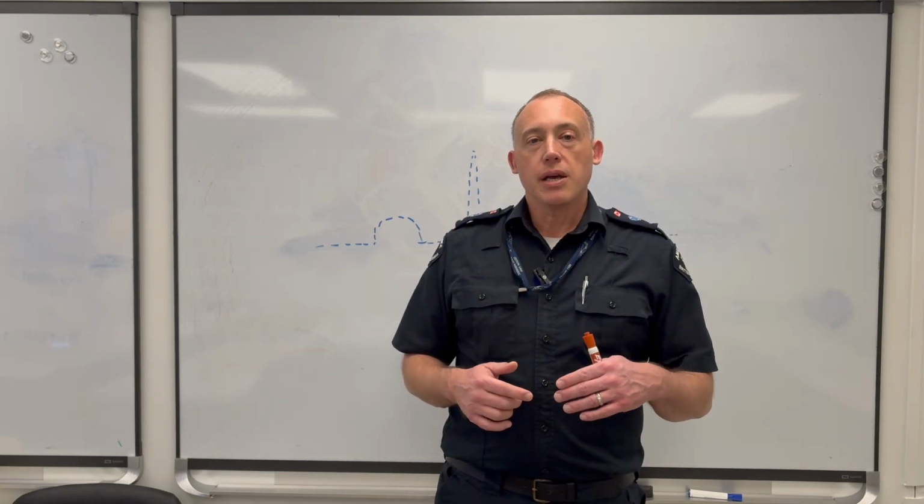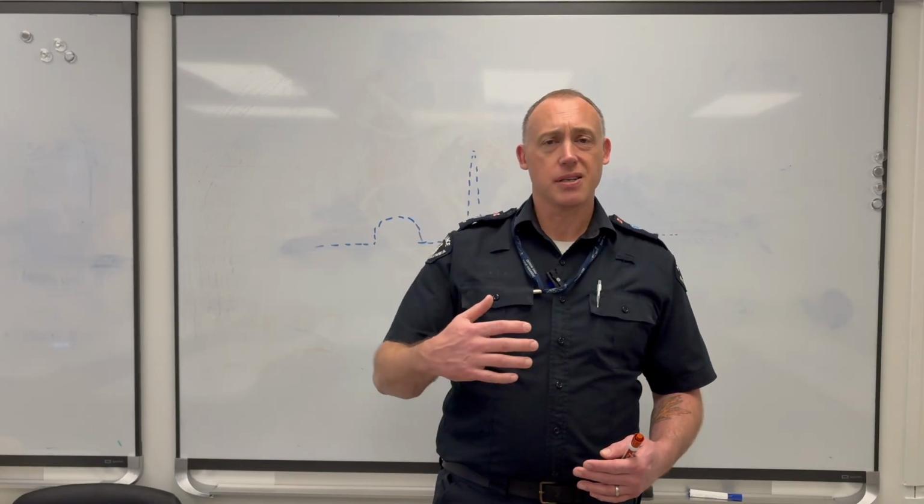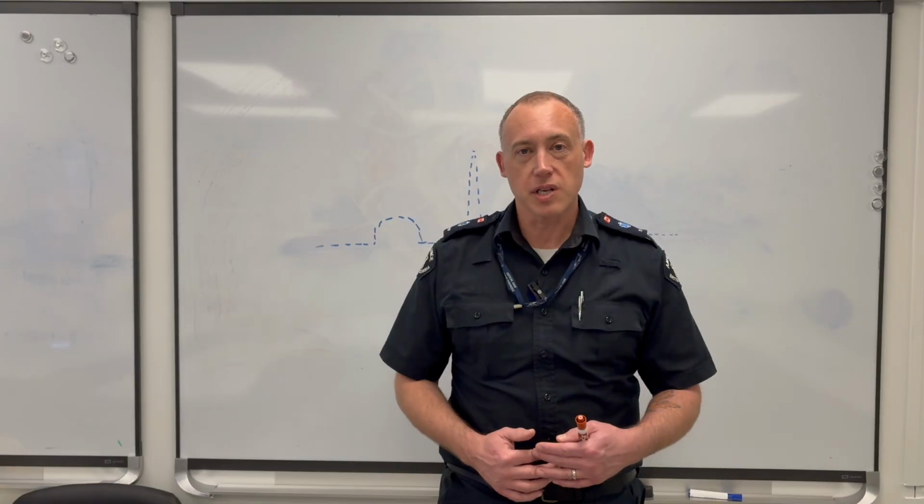What we're going to do is get into some pathology. We'll start looking at actual interpretations in terms of heart blocks and hypertrophy and all sorts of weird and wonderful stuff. So stick with me.